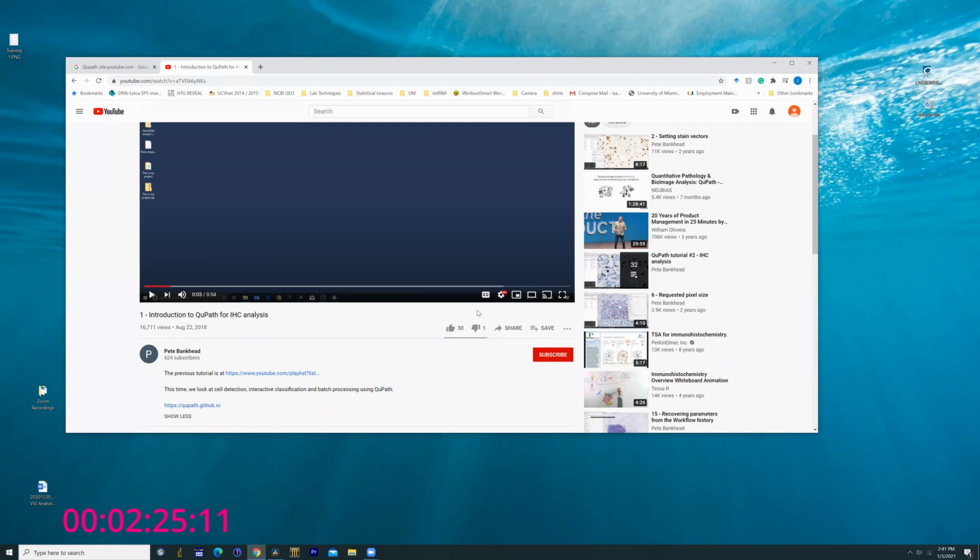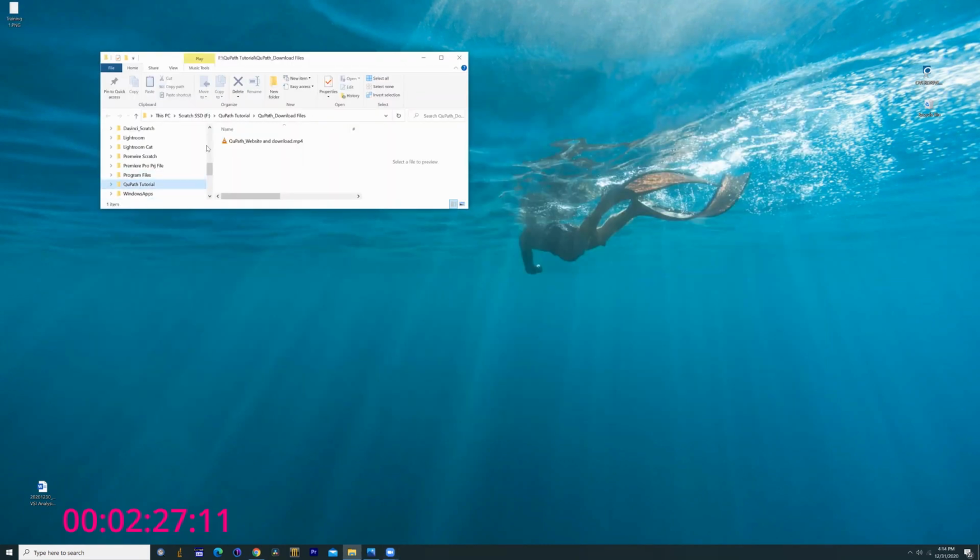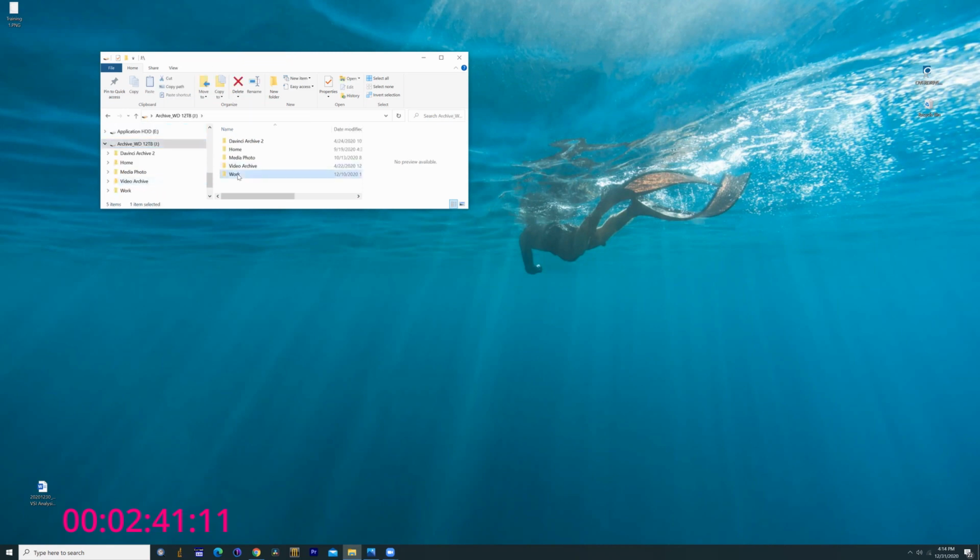Hello, guys. So this is Isaac from the University of Miami. I thought I'd install. I've now gone to the website. I have downloaded the files. In this case, I've chosen to put them into a permanent location I want to share with a collaborator later on. So we go to the data file.